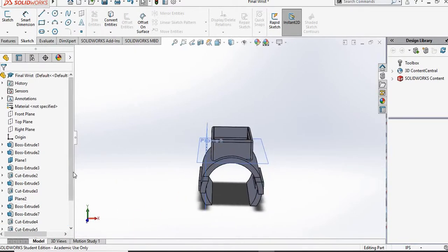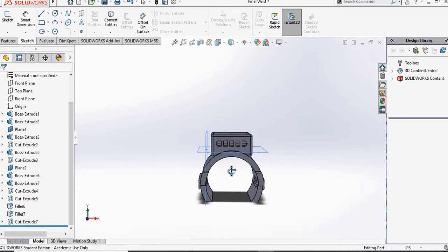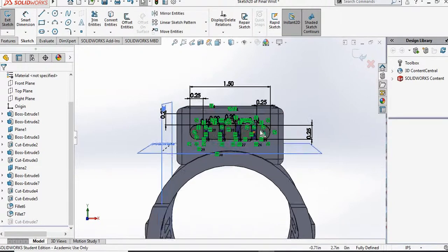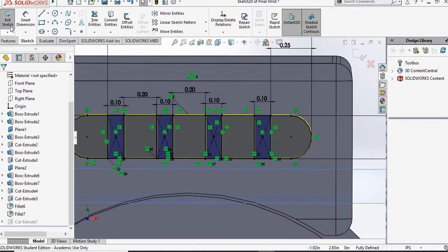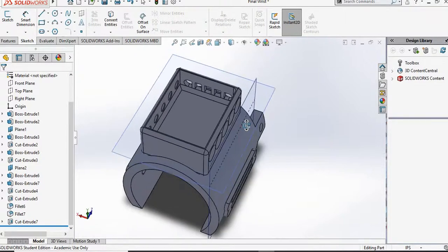And last but not least, we created a cut into that rectangular bracket. We made 5 cuts so that our strings can go through. And here are the dimensions for that. Okay, so we use lines and arcs to fully define our sketch. Okay, and here's the closer dimensions on the inner rectangles. Alright, and this is what a final product should look like.